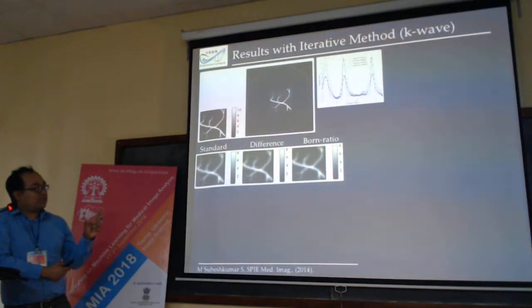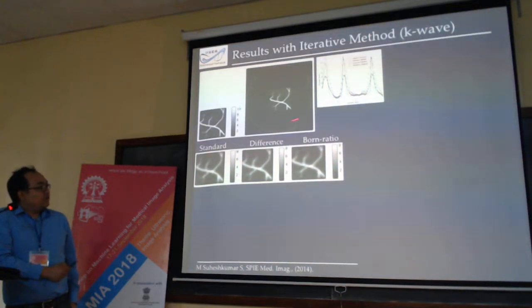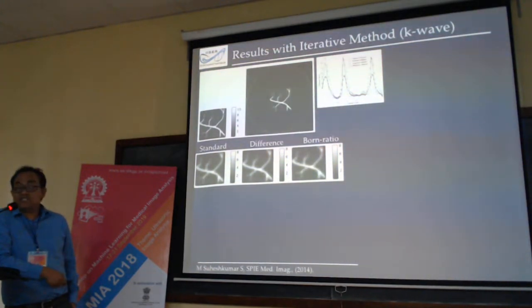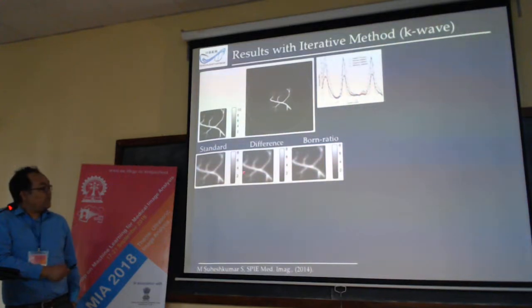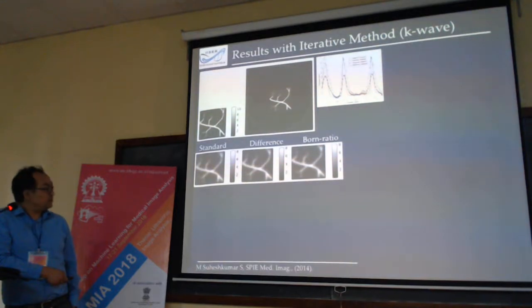That is because of the proper coupling of the ultrasound signal, to reduce the loss of the signal due to reflection at the interface. So for simplification, people neglect the signal coming from the water or the gel. What we studied was whether it gives a signal, though minimal. If that is the case, whether we can discriminate that signal, and what the resulting improvement in the imaging is. That is our concern.